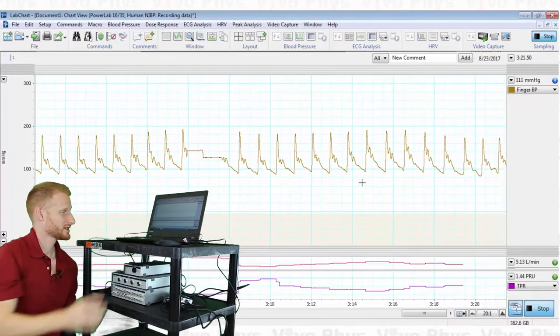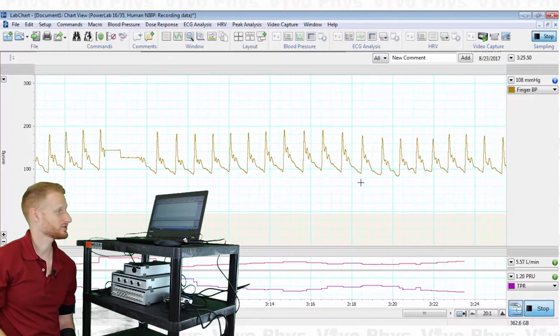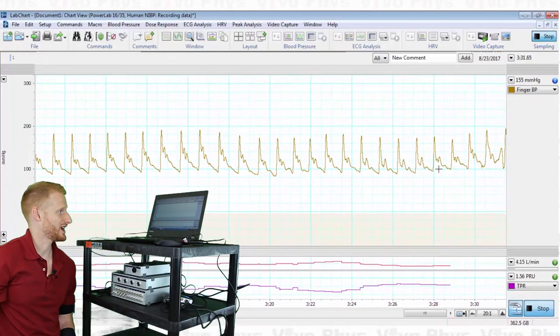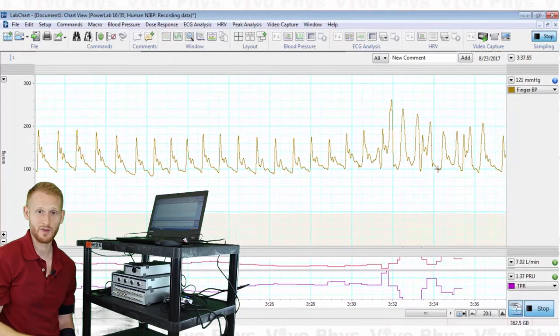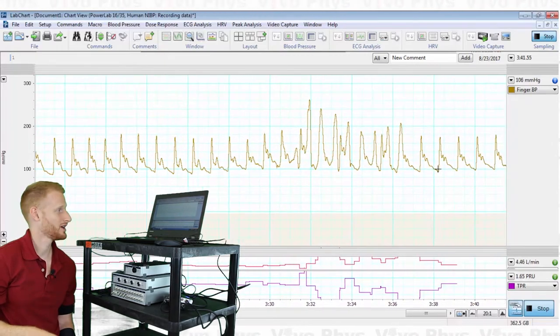You also want to make sure the person keeps their hand nice and still. If I wiggle my finger, you can see the waveforms go from a nice uniform shape to looking really jagged and irregular. That's bad data. Make sure the participant stays still so you can get quality data throughout the entire recording.